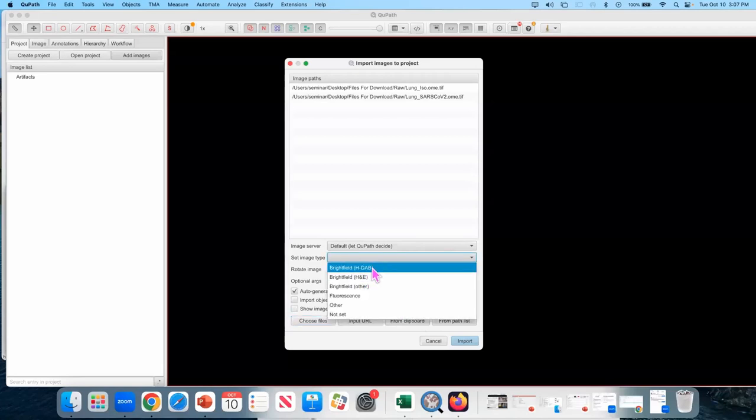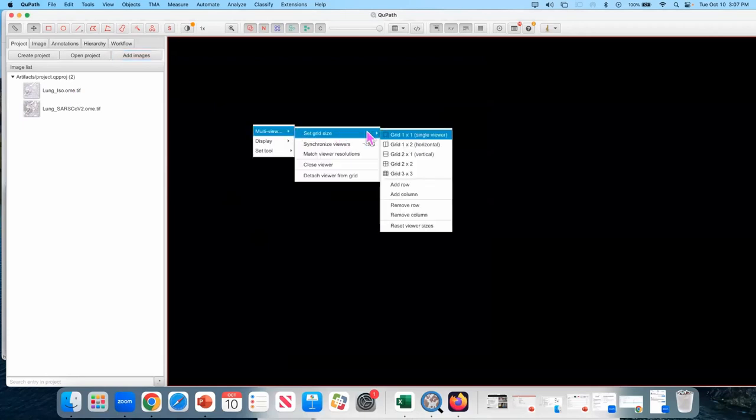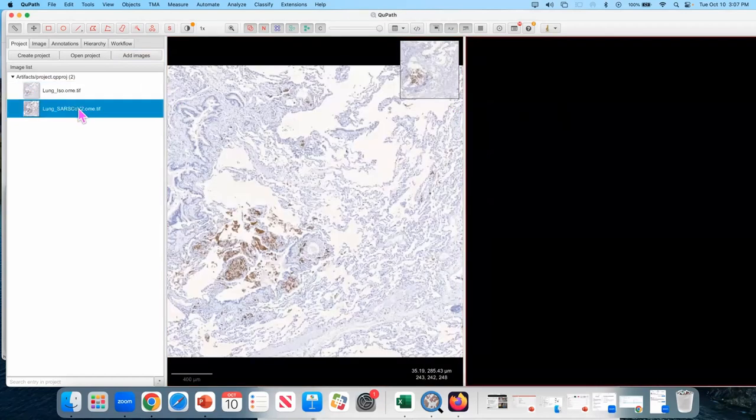I happen to know that they're HDAB images. And I can right click, multi view, set grid size to 2x1. Right click, grid size to 2x1. And now I have two viewers. I can open my isotype on the left and my staining on the right.